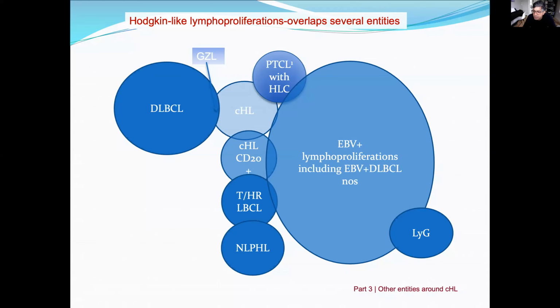Lymphomatous, lymphomatous polyposis, sorry. See, I'm forgetting my own base. Polyposis. So mantle cell lymphoma can present like polyps in the ileum. So that's called lymphomatous polyposis. Okay, so that's good. I threw a barrage of things at you right now, and you must be tired. So I'll do a couple of slides, and then we will do some unknown slides.